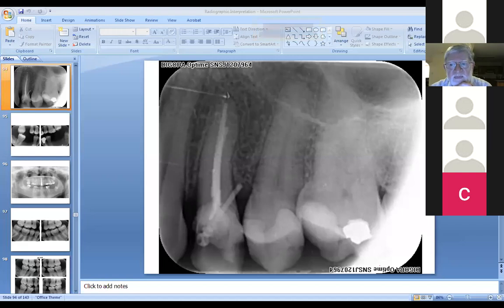Beautiful, thank you for that. Another question from Sherry. With self-resorption of unerupted eights as seen on the OPG, is extraction indicated or just monitor?